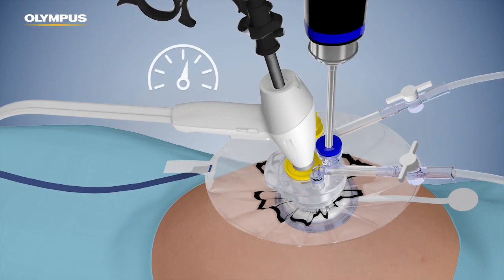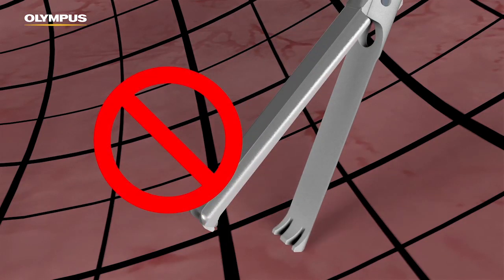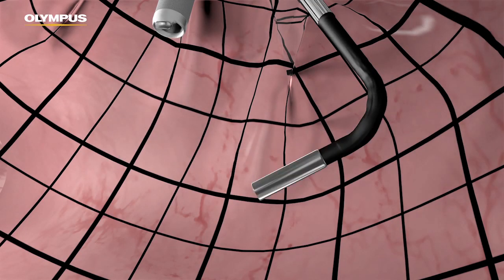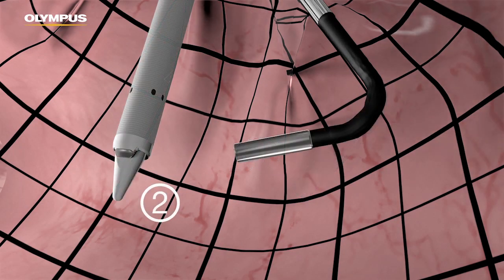Continuously monitor the pressure in the abdominal cavity. Do not touch the pneumo liner with an open tenaculum. When cleaning the scope, remove all instruments first, and then the scope. Remember the correct order for reinsertion, including the obturator.